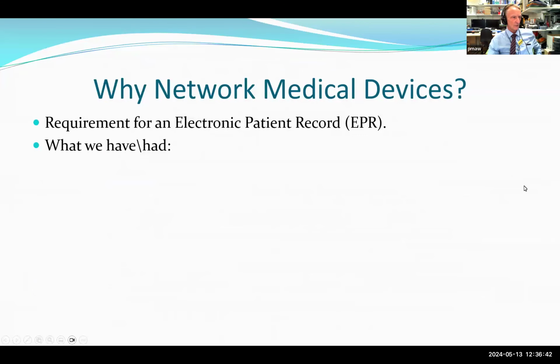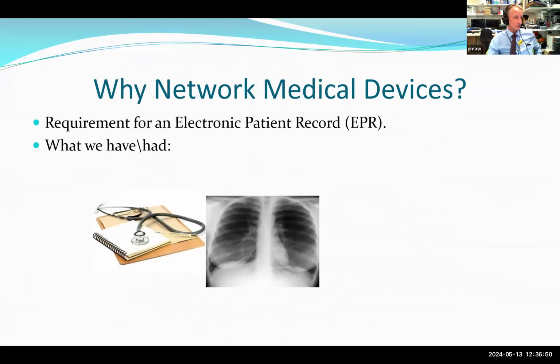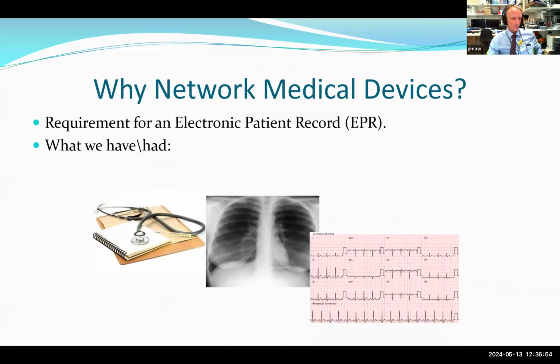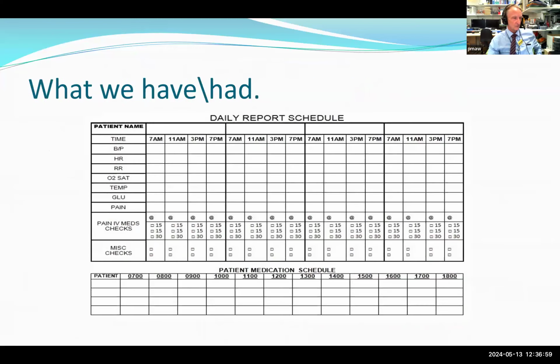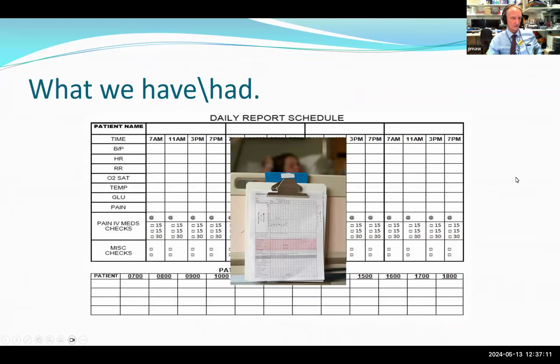So why do we network medical devices? What we used to have was lots of paper notes, handwritten by doctors, plain film X-rays, and lots of paper charts. And then we had the bedside charts where readings were manually transcribed by the staff at regular intervals, and this obviously changed on a regular basis, and that hung on the end of a bed on a nice clipboard.